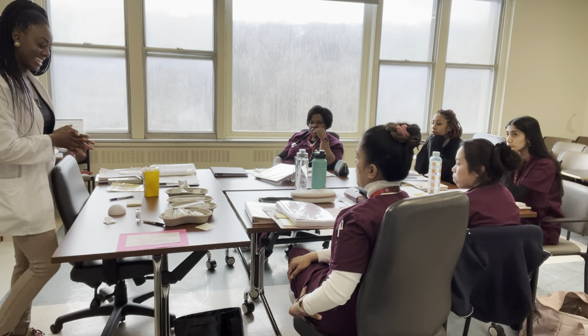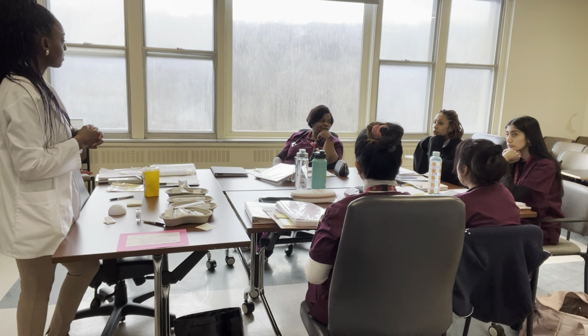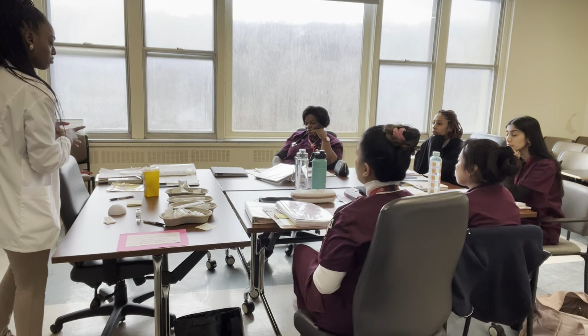It's really when you're going to inject it into the person's skin, because you're dealing with blood. Thank you. And just to ask, is it true that if you inject the insulin too quickly, it burns the patient? That's right, it burns when you inject too fast.